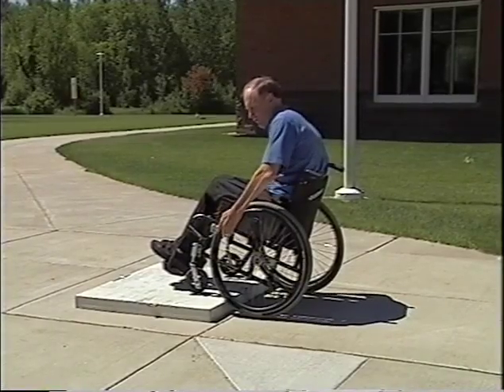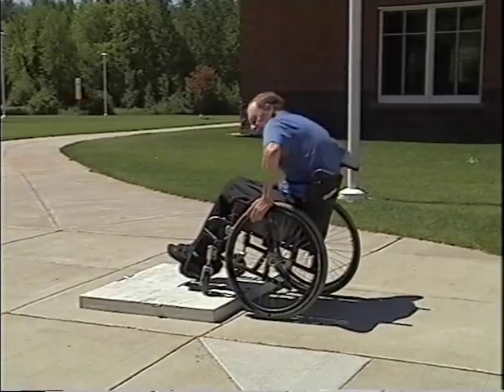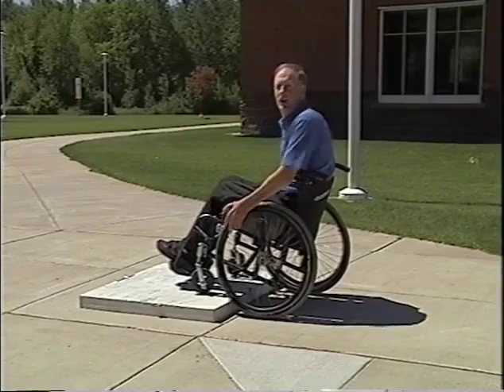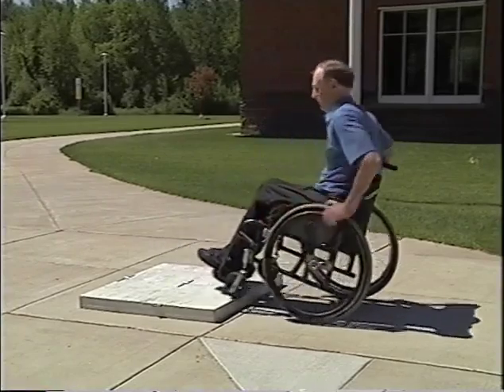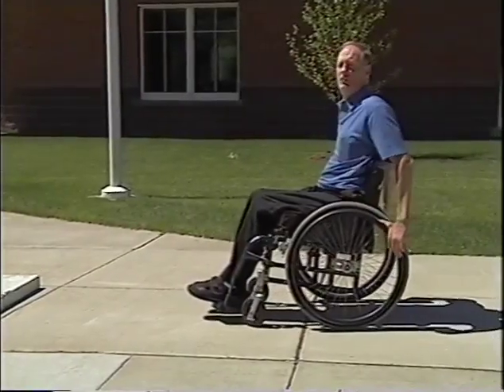And now, notice where my hands are. They're in front of the axles, ready to drive all that weight forward and up over the hill. So let's look at it and put it all together in one smooth little thing. You don't need a lot of speed here.